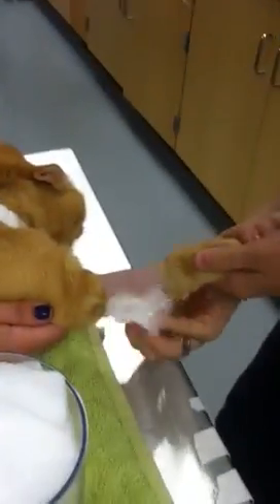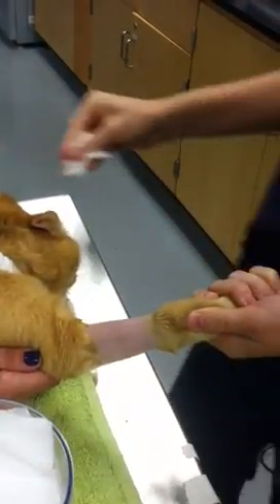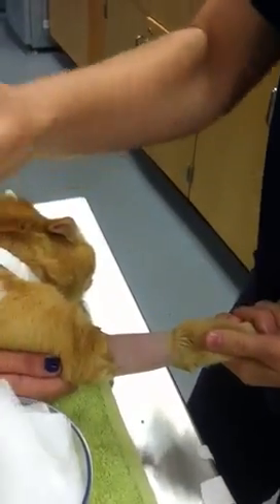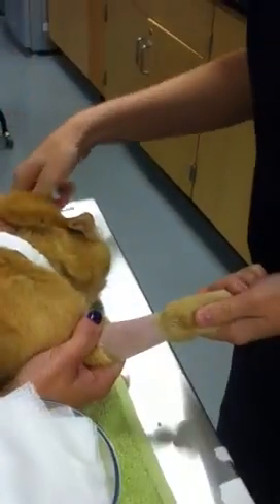Once the site is scrubbed, we can go back with some dry gauze on the back side of the arm and just pat it down so that the tape will stick a little easier. This also gives me a chance to get my fingers dry so I don't slip while placing the catheter.